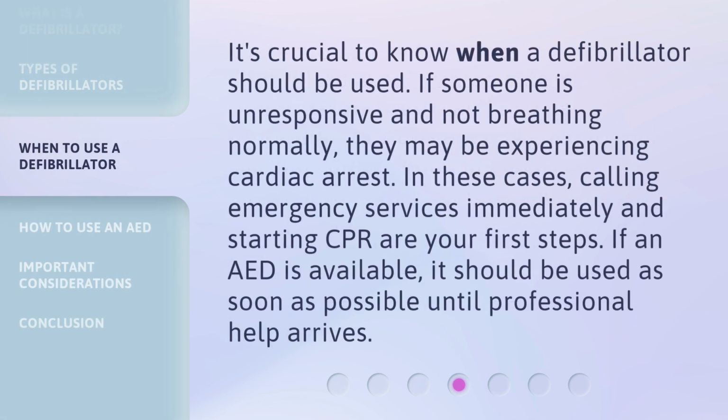It's crucial to know when a defibrillator should be used. If someone is unresponsive and not breathing normally, they may be experiencing cardiac arrest. In these cases, calling emergency services immediately and starting CPR are your first steps. If an AED is available, it should be used as soon as possible until professional help arrives.